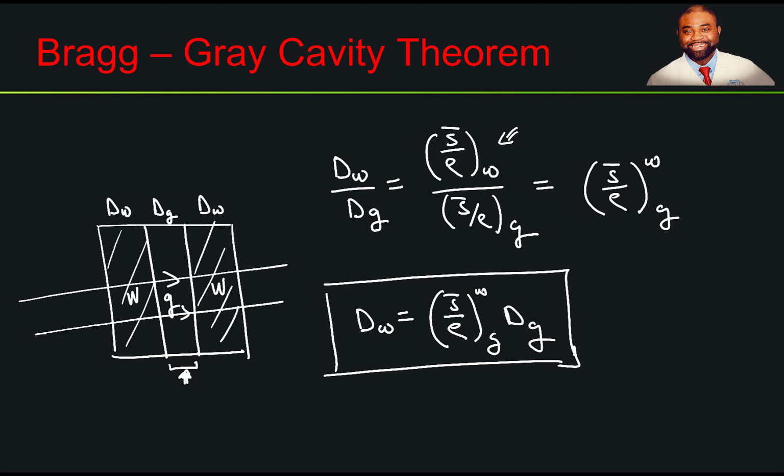This is a beautiful equation that provides us a practical way of measuring the dose deposited within a given volume.